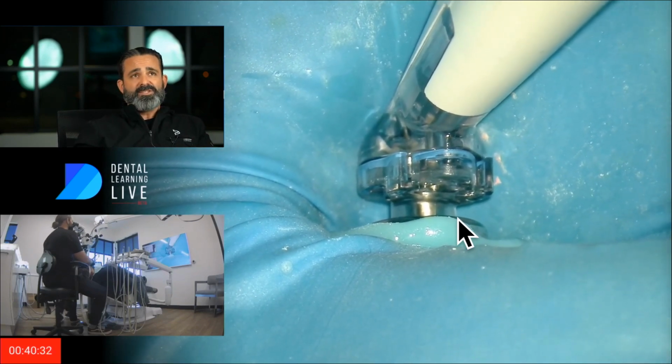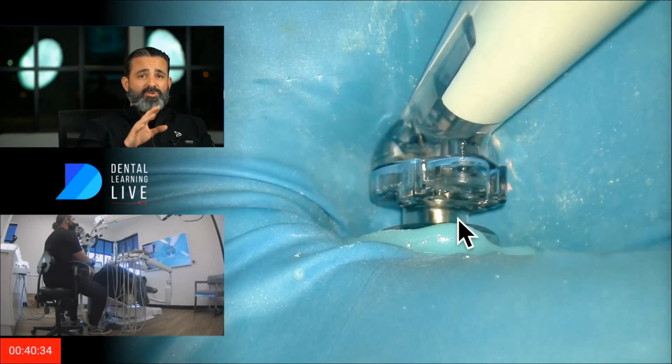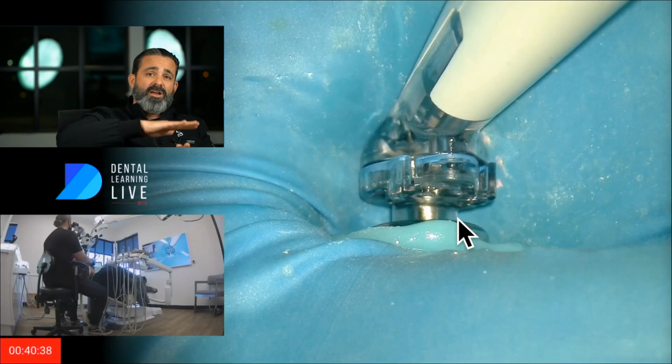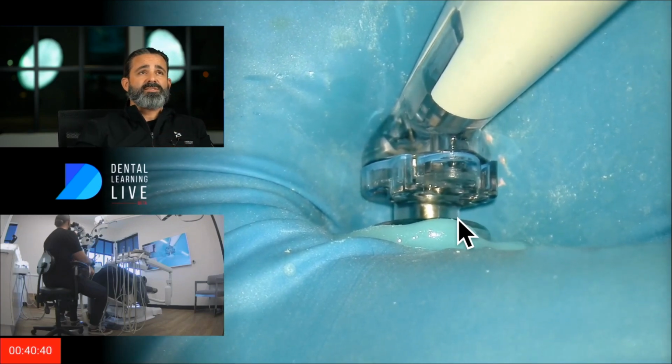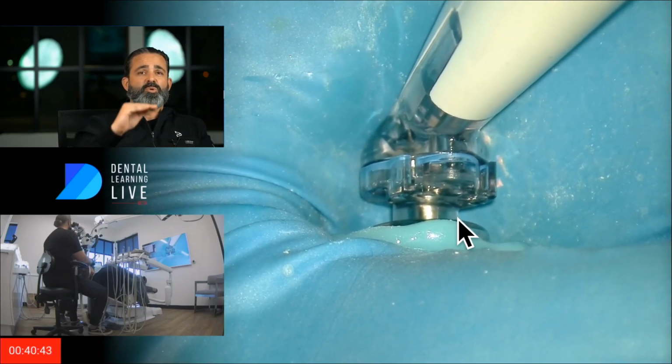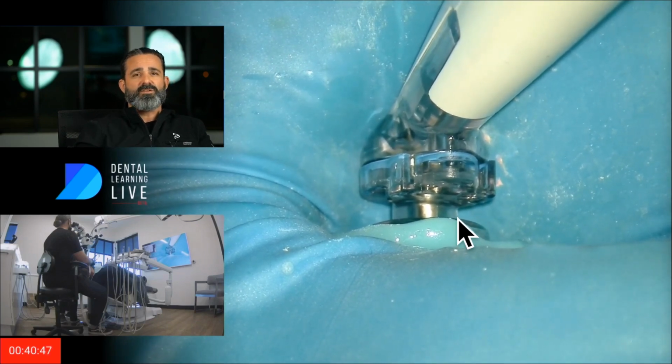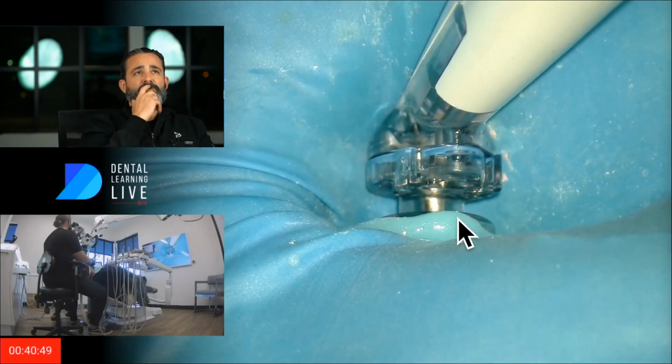And the difference is there's no bubbles or foaming. It wasn't like I caught a leak. I just had enough of a surface tension break along the sound seal to let that sort of pool up. And you'll notice that there's a difference. They sound different than when you're discovering an air leak inside or seeing a foaming bubble inside.